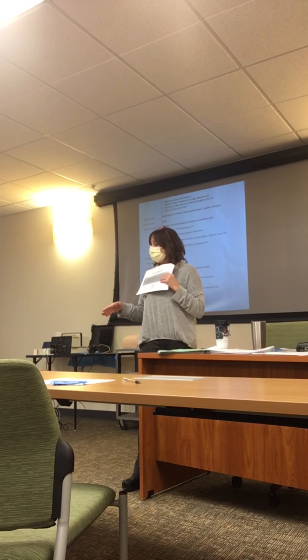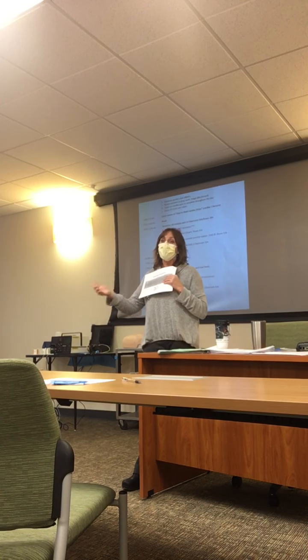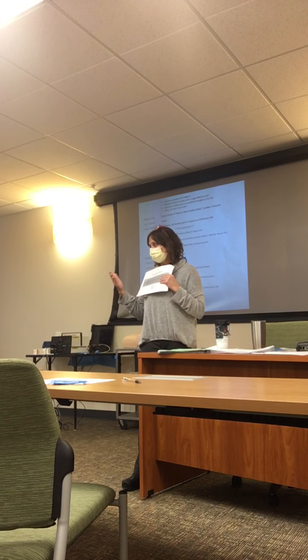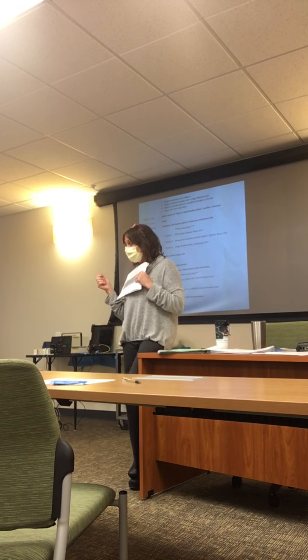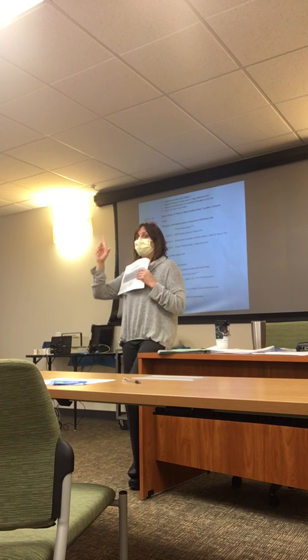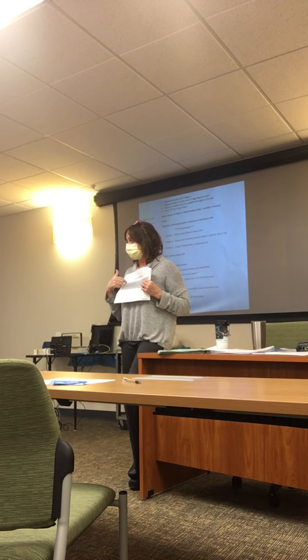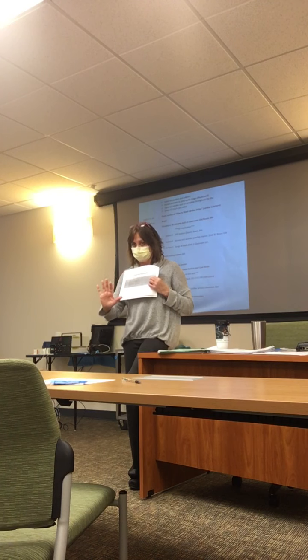We're going to get vitals on them, probably an EKG if they're alert, their blood pressure's okay. People can tolerate this for a short period of time, but a lot of times what will happen is this is a preliminary rhythm to going into VF. So we want to quick like a bunny, get the doctor in there. A lot of times they'll try to cardiovert them. Remember the difference between cardioversion and defibrillation? We're going to mark the R waves, and you can definitely see the R waves on the top of this. And they'll shock them at that time to hopefully get their heart back into a more normal rhythm.